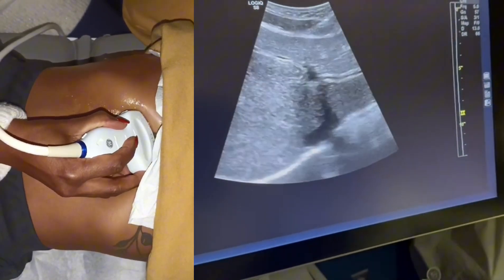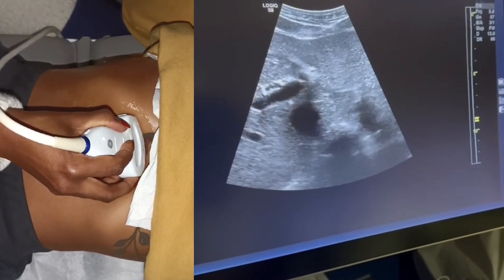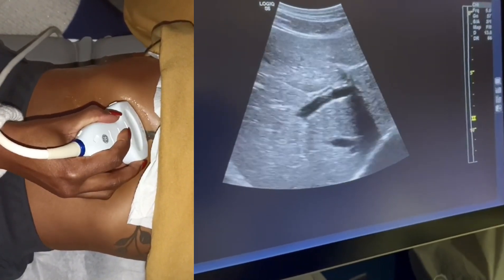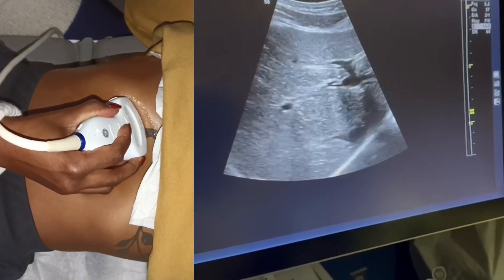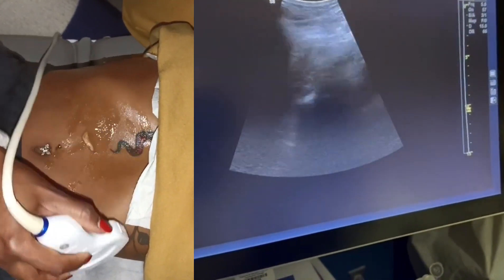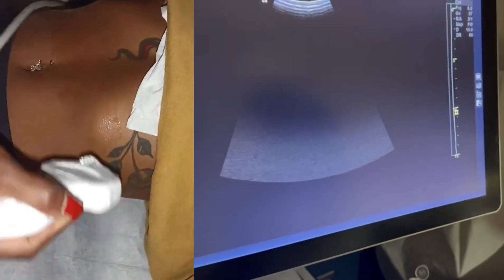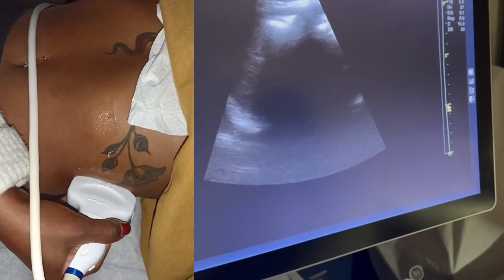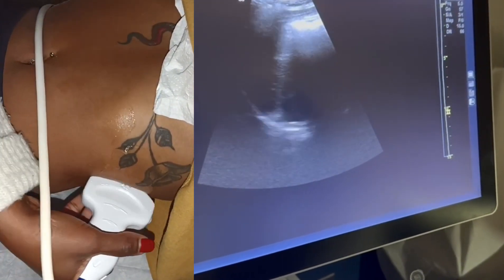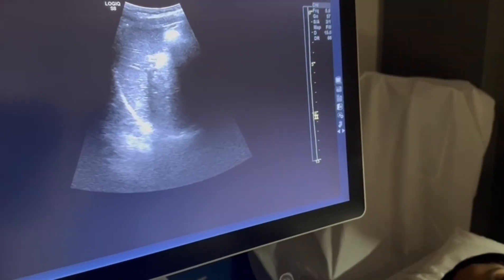Hopefully this gives you a basic, quick understanding of how to do a complete hepatoporto Doppler. Many clinical sites will also expect you to take a look at the liver and get a good measurement as you scan. You'll also want to take a look at the spleen — you can see the kidney and the spleen right in that image. Best of luck.